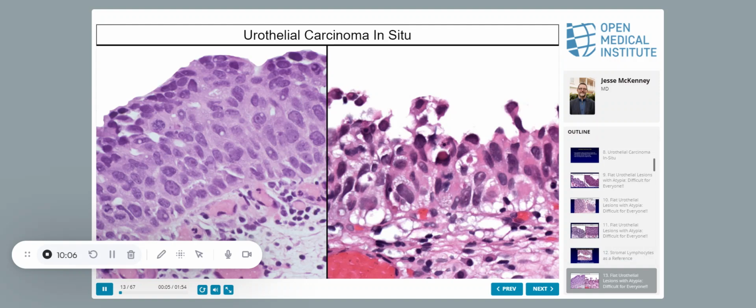Again, a lot of the nuclei are rounded up, but there's, again, a lot of variation in size and shape. There's a little bit of clumpy chromatin. This one is not as hyperchromatic as some of the other ones I've shown you. You can see the cytoplasm has a lot of pink cytoplasm, right? So that doesn't matter. Again, what I should have done is said, look at this lymphocyte. You could probably put 8 in there. In this case, if this is a lymphocyte, 1, 2, 3, 4, 5, 6, 7, 8. So this is markedly enlarged.